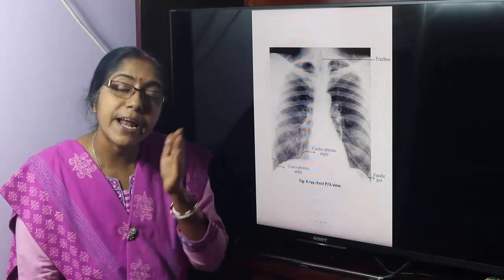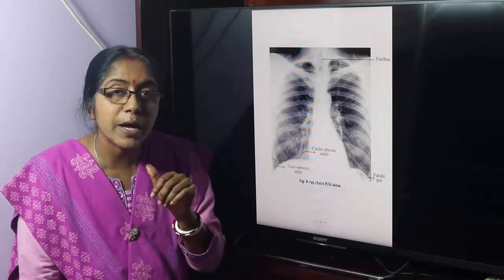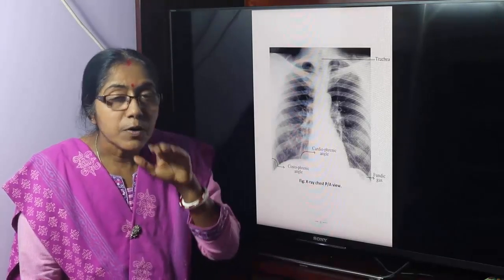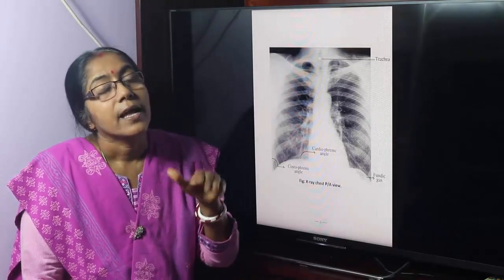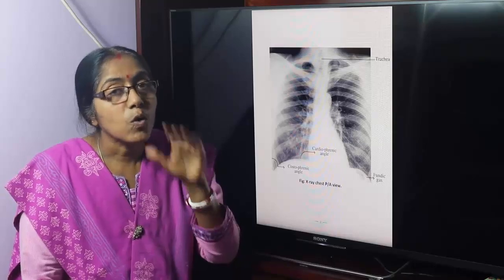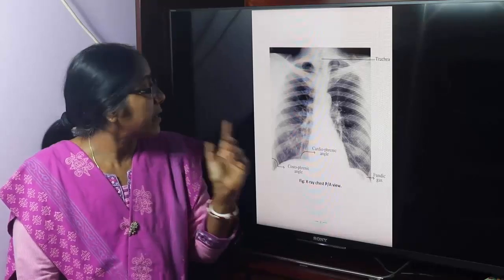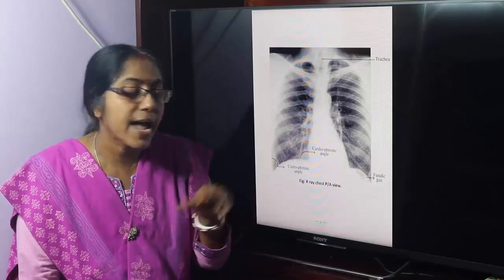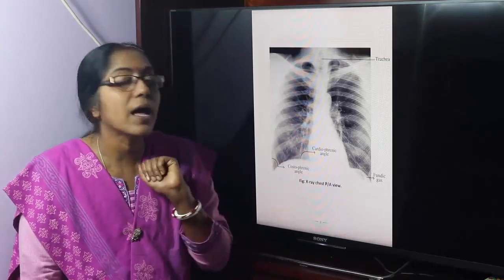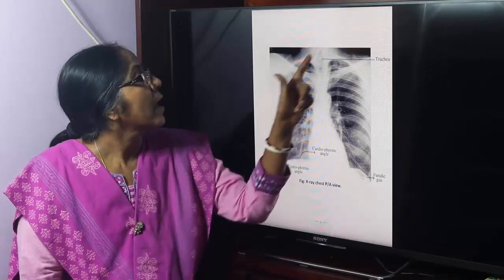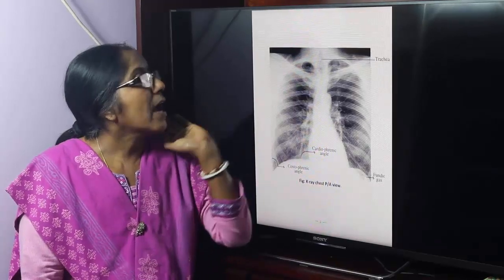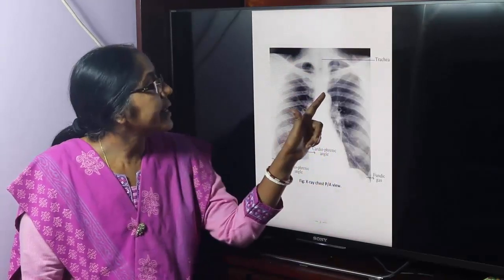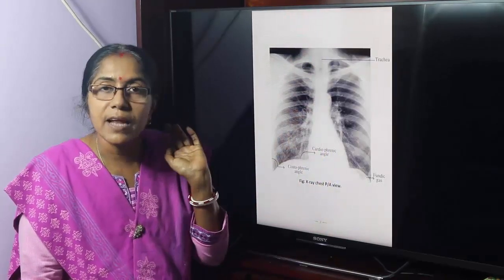We have to ask questions. Why is the right dome higher? The right dome is elevated because of the right lobe of the liver. The right dome is slightly higher than that of the left dome. This is the tracheal shadow.